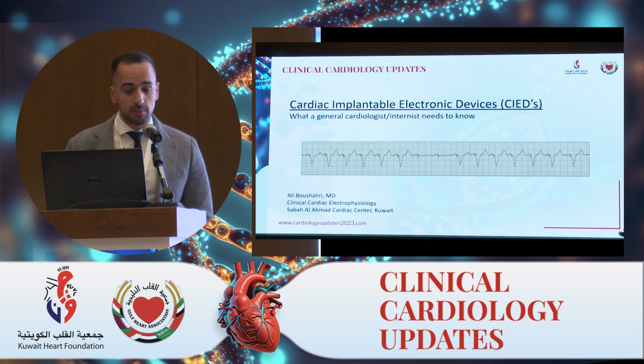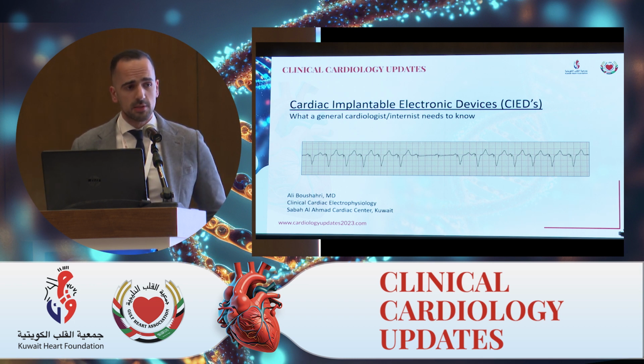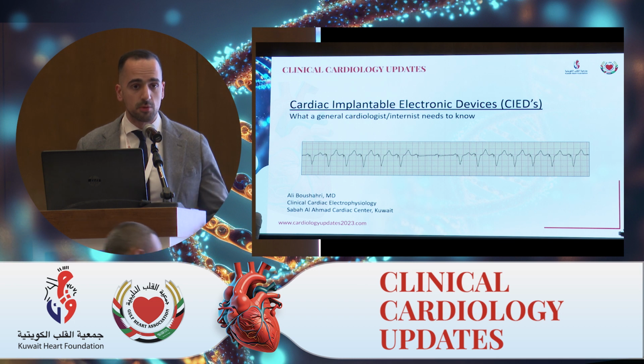I'm going to be talking about cardiac implantable electronic devices, which is a general term that involves any device we implant in the body to monitor and/or treat the electricity of the heart. This includes pacemakers, defibrillators, in addition to implantable loop recorders.